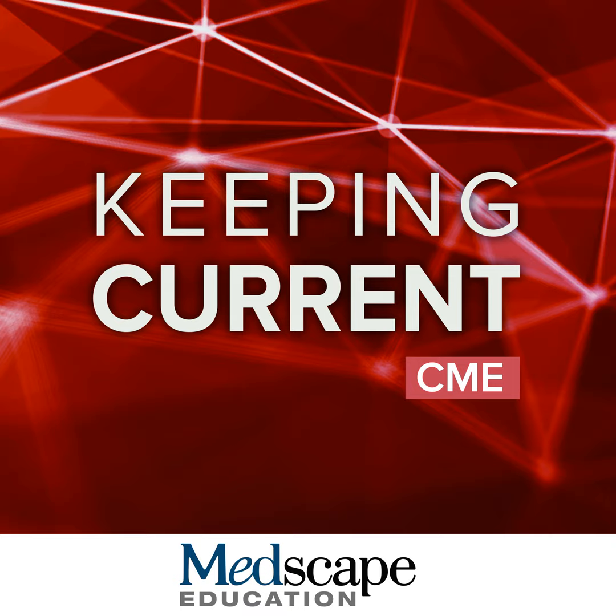It's my pleasure today to talk to you about gadoxetic acid-enhanced abbreviated MRI. So current guidelines for screening for HCC from the AASLD recommend ultrasound and AFP every 6 months. And so here we have an ultrasound showing a big nodule in the right hepatic lobe, and we know that AFP can also help with screening for HCC.